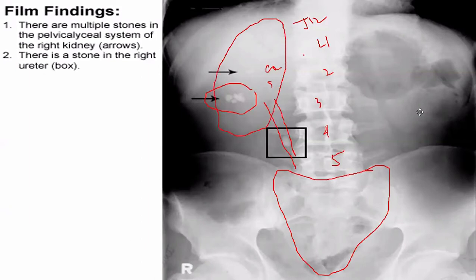So they are there. Look at the shape. They look like the staghorn. This one is a staghorn actually. This one is most likely a calcium stone because it does not form like a staghorn. But usually you see them both. What is important is you see this is the psoas muscle. This is the psoas.